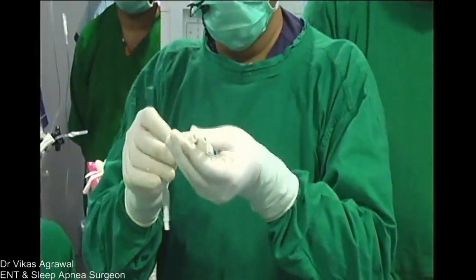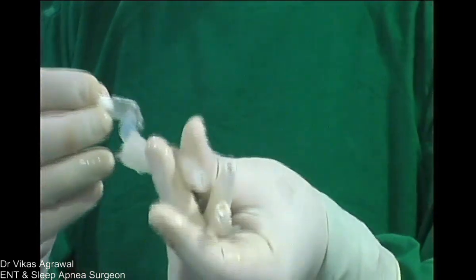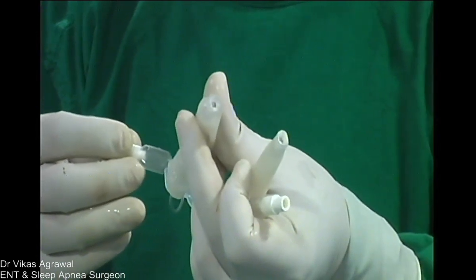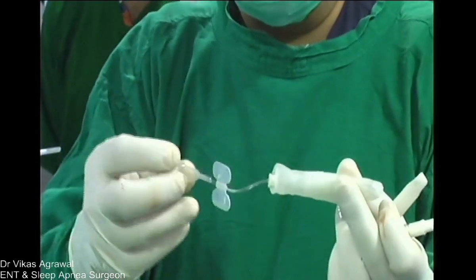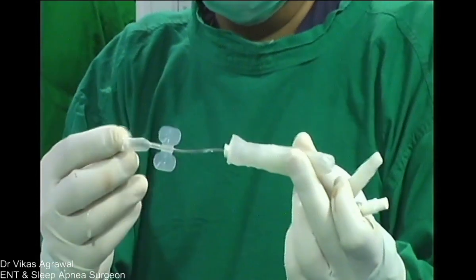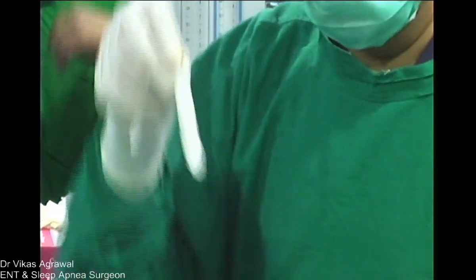Now see, this is Rapid Rhino. So this has got a hole. Can you see that hole? Can you zoom in further? So this is the small airway, and this is coated by CMC, carboxymethyl cellulose. This has got the bulb which can be inflated. So what I am going to do is put it inside and then inflate the bulb. Now can you go to the internal camera again?